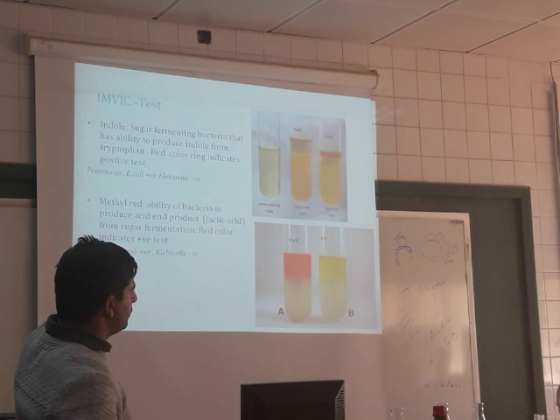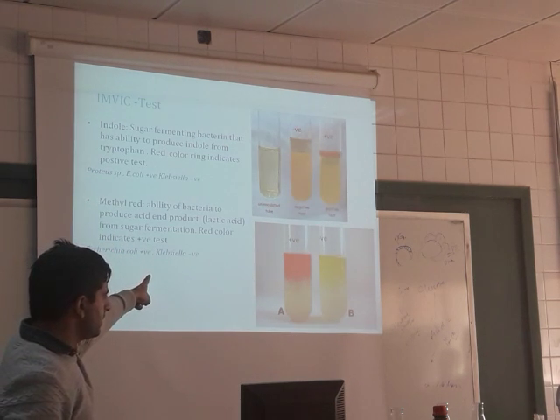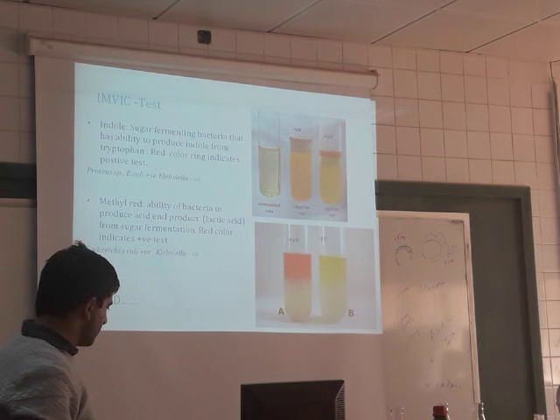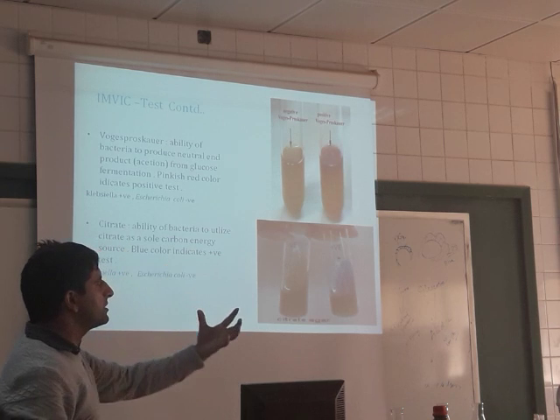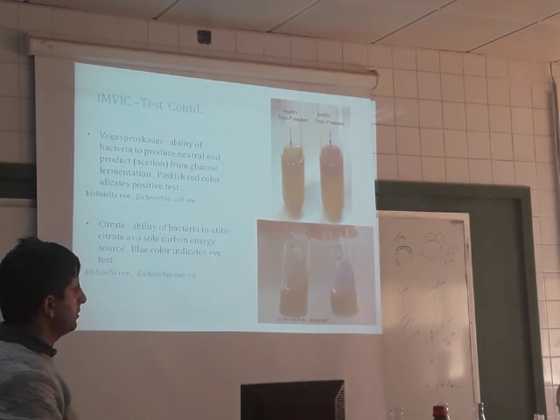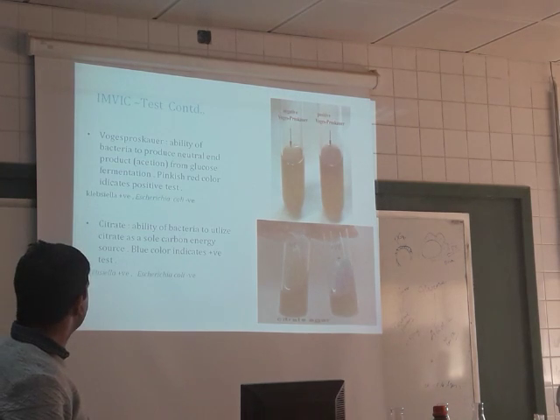Compare it with the methyl red test, where the end product is acid. Yes, the end product is acid. Here in Voges-Proskauer, the end product is acetoin. Acetoin is a neutral product. This is the difference: neither acid nor base.